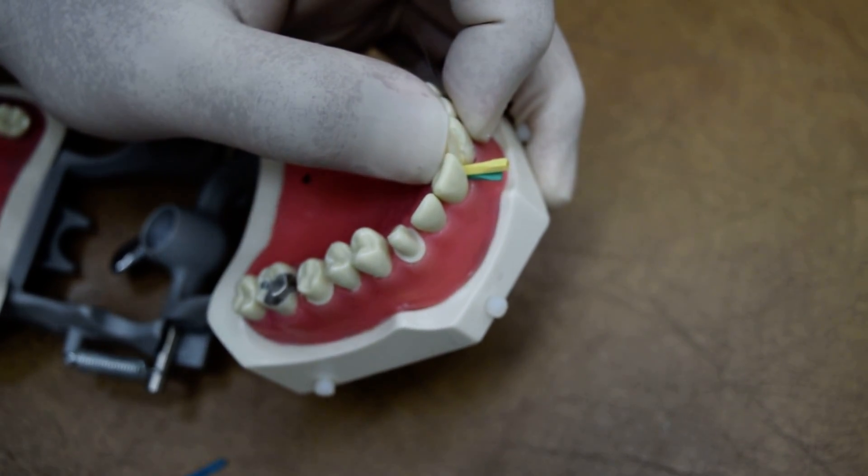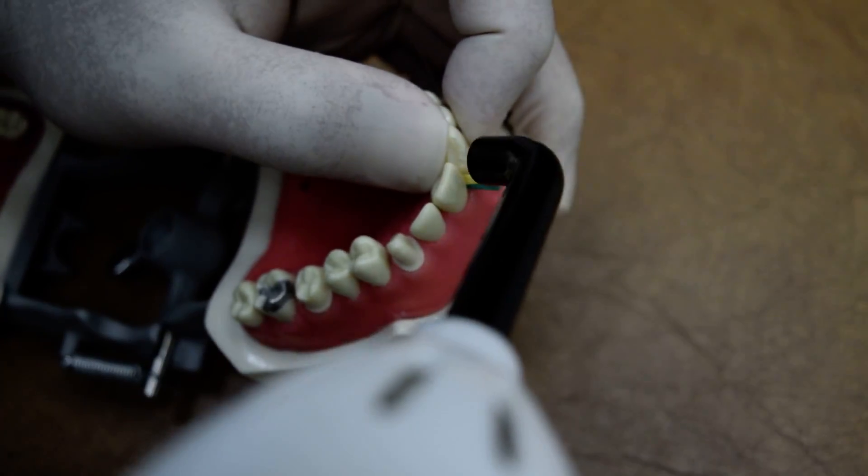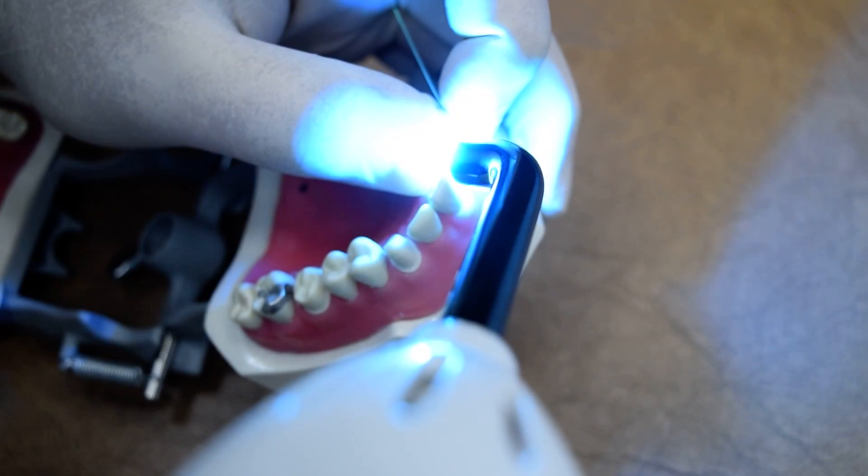Then we will apply the light cure from labial side.